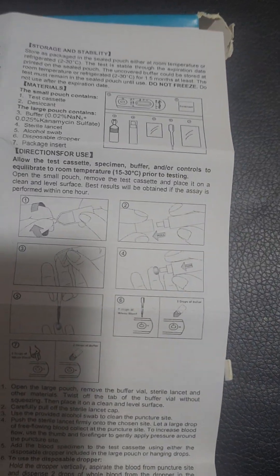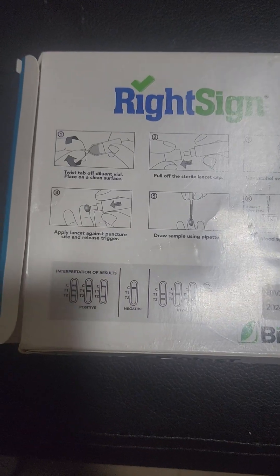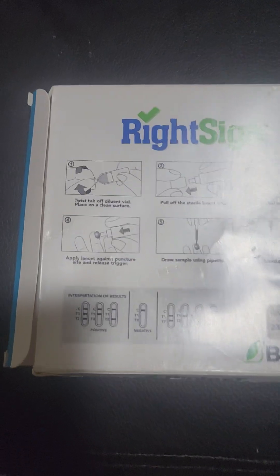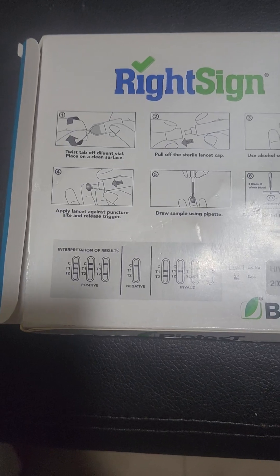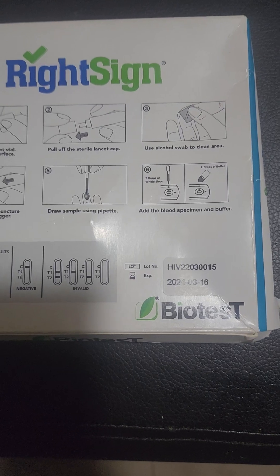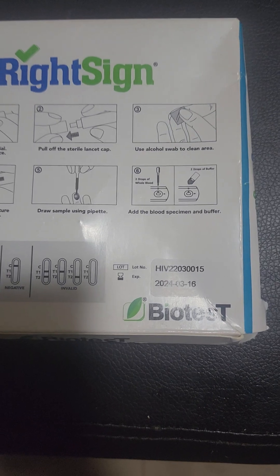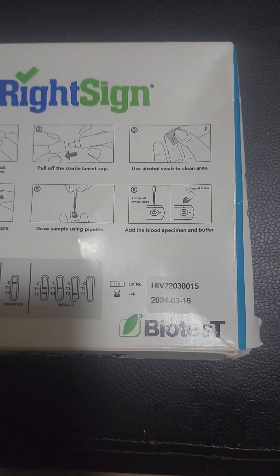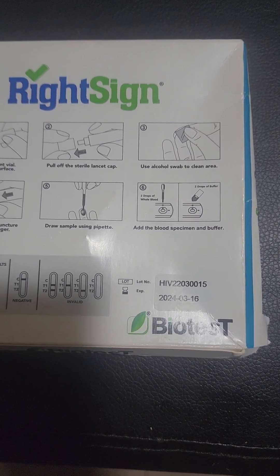The manual covers how you conduct the test and how you will evaluate the results. This information is also repeated on the box that the test comes with. The box itself indicates the batch number and the expiry date — this test will expire on the 16th of March 2024.